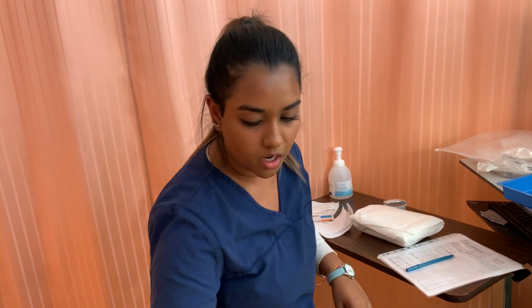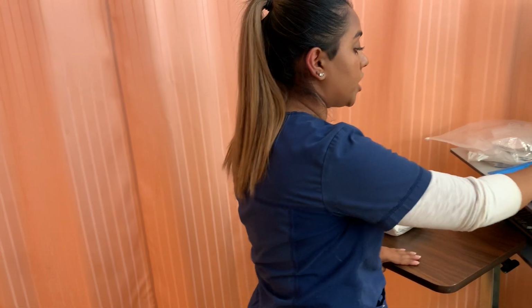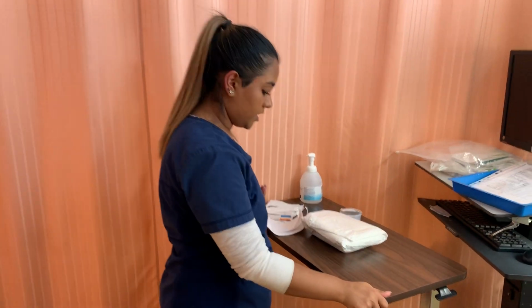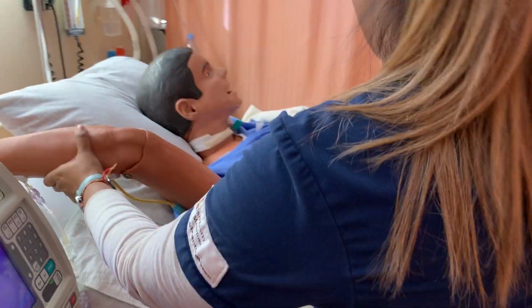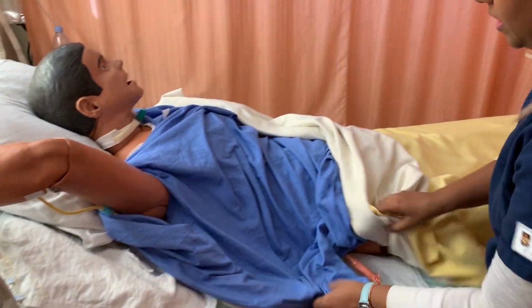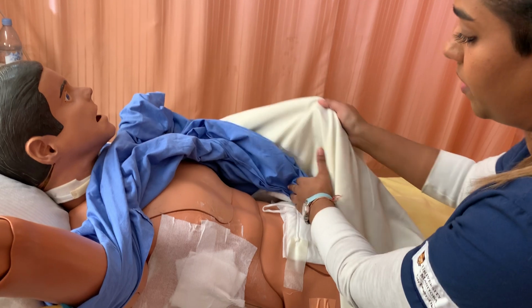Okay. So now I'm just going to be changing your chest tube dressing. Is that okay? Yeah? Thank you. Okay, so I'm just going to take a look at it first, okay? Just going to position my patient. I'm just going to move this completely out of the way. We'll move it back after.